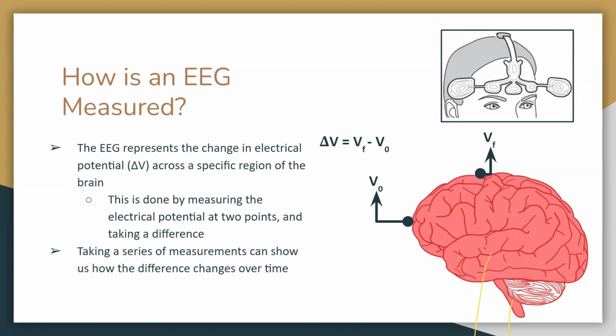So the real answer is it depends on the electrical resistivity of your patient's brain, which is why they're not recommending a certain value. They're just letting you set it. You get pretty consistent values within a certain range, but what we care about in logarithmic space is not where 0 is, because I can define 0 dB to be anything. That's why the units are made up.